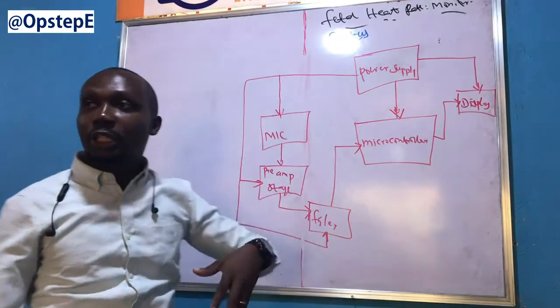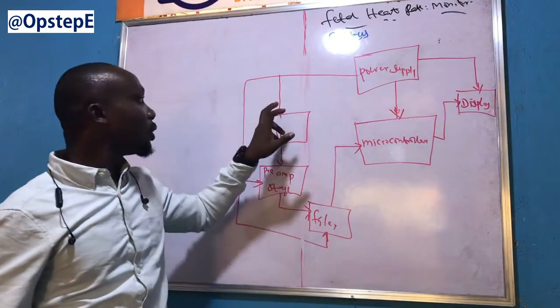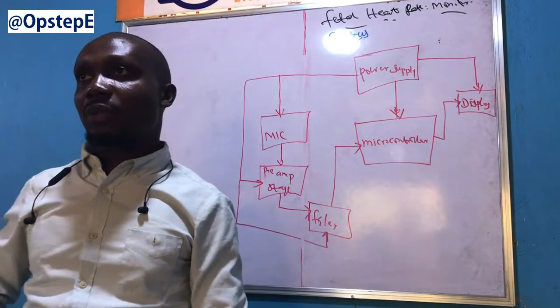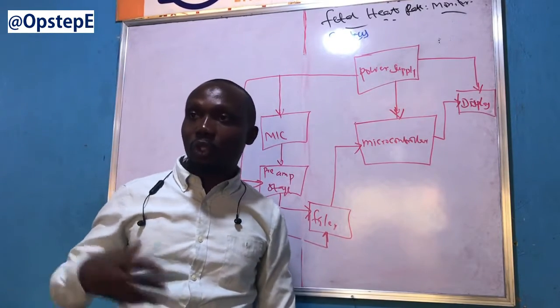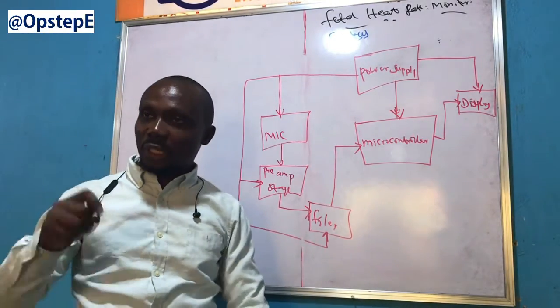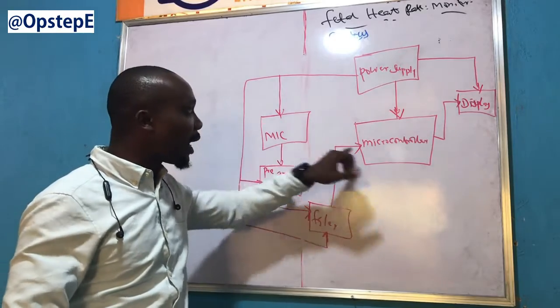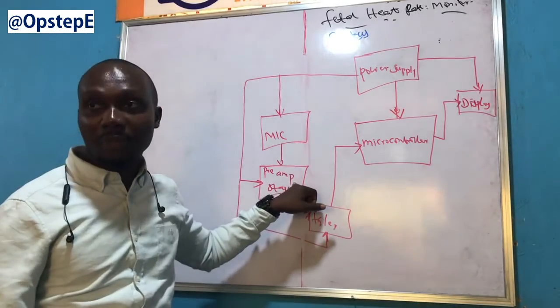Now, for the heart rate to be picked up, you are going to need a microphone. The essence of the microphone is such that the sound being made by the baby, or by the fetus in the womb, can be picked up. Because of the nature of the signal, it could be weak. The output from the condenser microphone itself could be so weak that we cannot directly feed it into the microcontroller. It's why we're sending it through a preamplification stage.